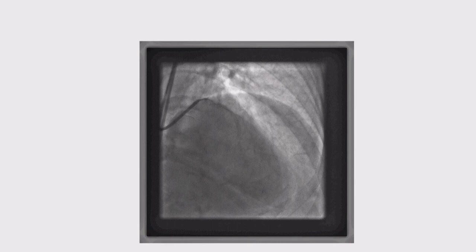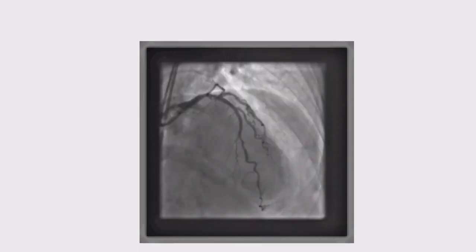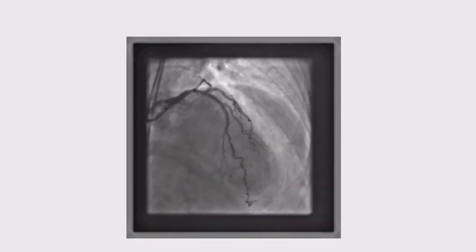Then of course there was some plaque shift, as you can see there is some lesion and plaque shift in the distal left main, so we ended up with another stent here, from left main to LAD. So that's a complication. It may happen with the stent, and of course we solved it with the second stent and POT for final optimization, and a good result with run-off afterwards.